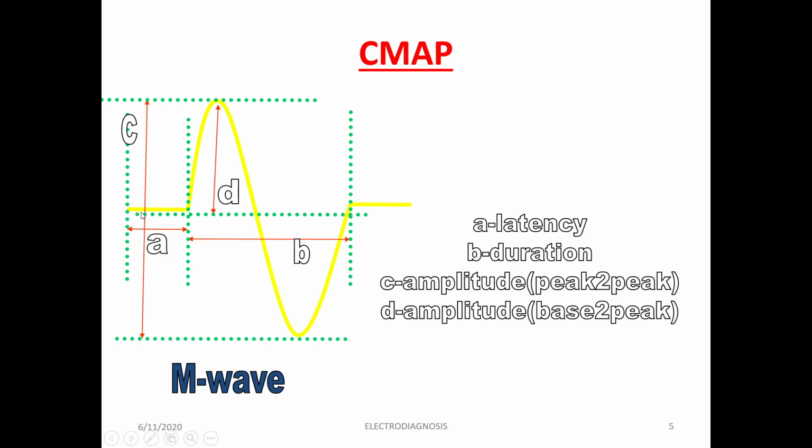It is the time taken by the impulse to travel from the stimulating point to the recording point. So latency has clinical significance. Now, here you can see the pointer. This is depolarization. This is repolarization. This is hyperpolarization.